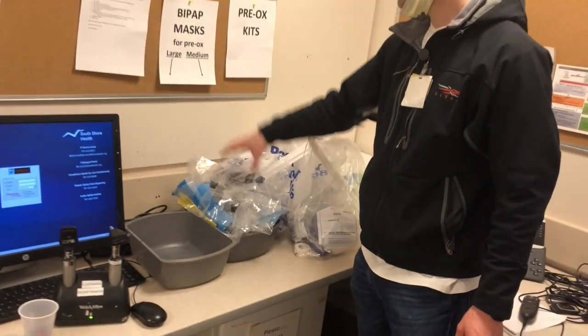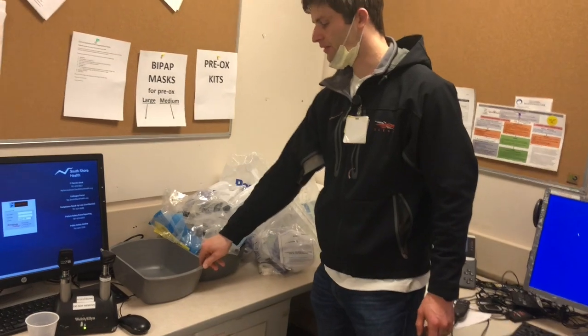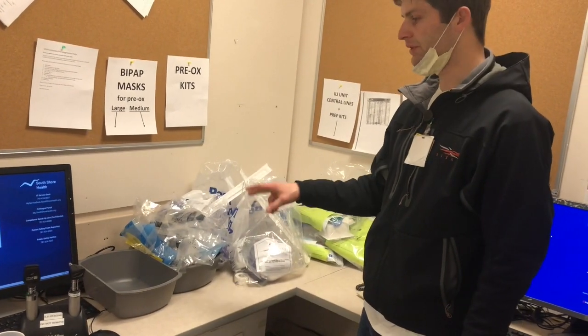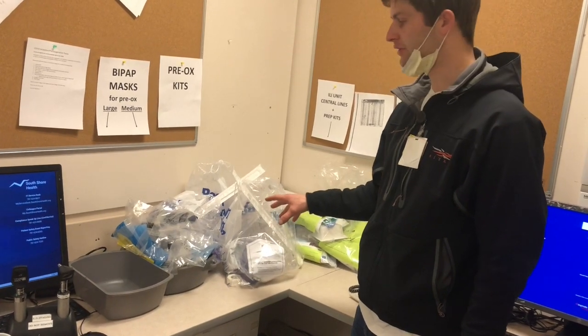For now we just have mediums, but respiratory is also going to bring down larges. So we're keeping those separate from the pre-oxygenation kits. But you will need a mask to go into the room with to put on your patient.